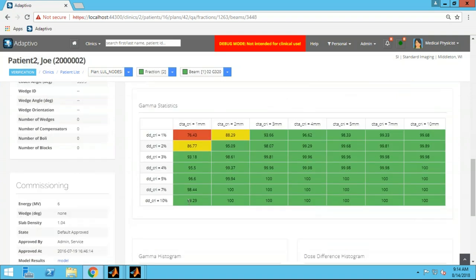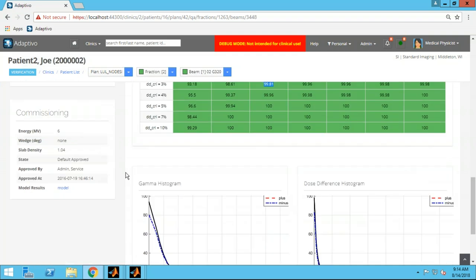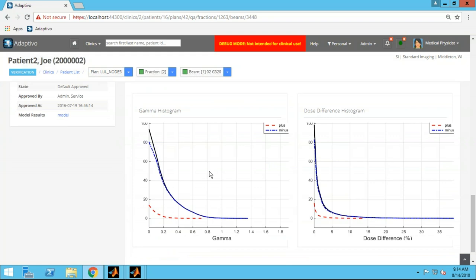We show what we call a gamma matrix. You may be set at 3%/3mm for your pre-treatment QA — that's what's reported on your plan overview and used for flagging on your home screen. But we calculate the gamma value for all combinations of distance-to-agreement and dose-difference criteria, so you can see not only where you are at this point but where you start to hit warning and failure regions as you tighten those criteria. We also show gamma histograms and dose-difference histograms.